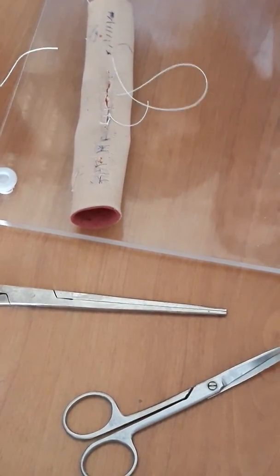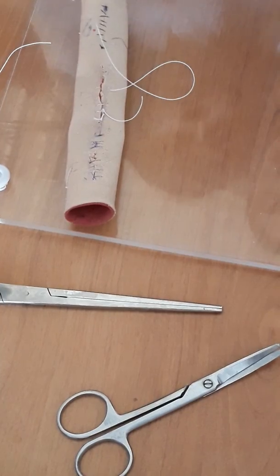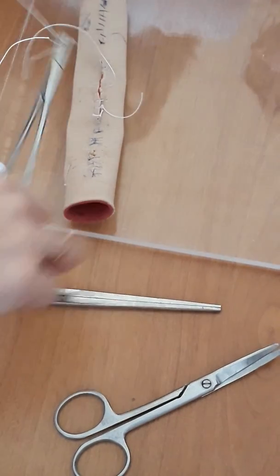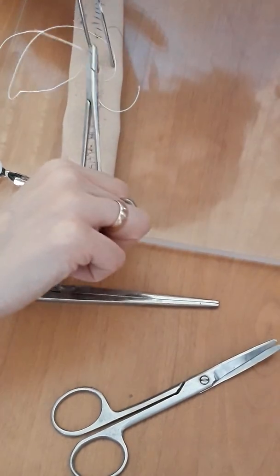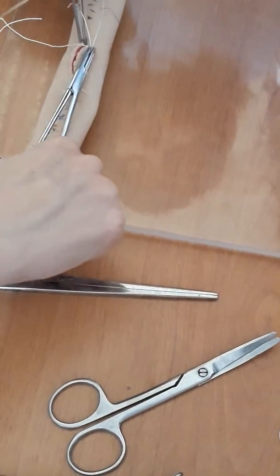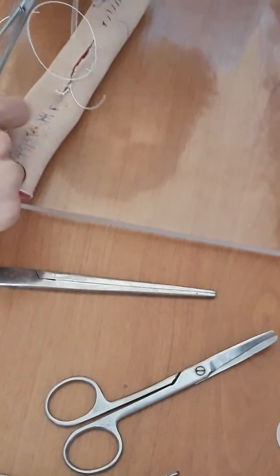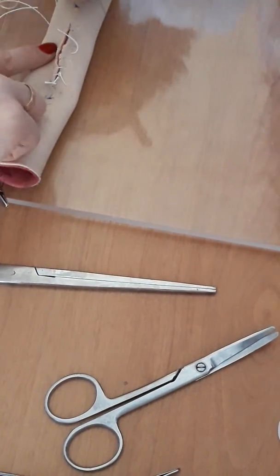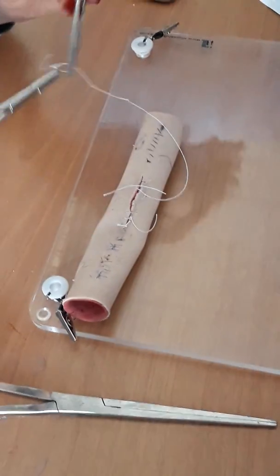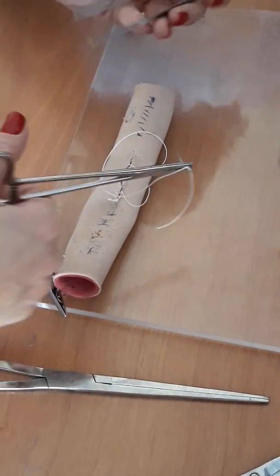After that, I will demonstrate also continuous penetrate suturing, Multanovsky-Reverdin. What should you do? You should make a loop and stitch 5 millimeters on the one side. On the second side, you should put the needle inside of the loop, and after that tie it. And repeat.